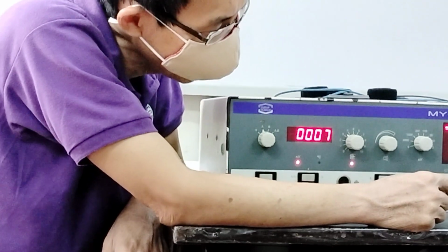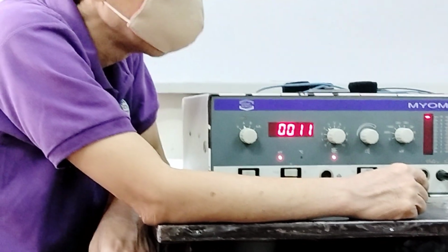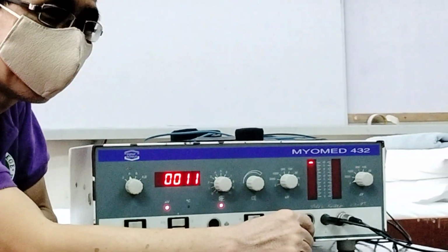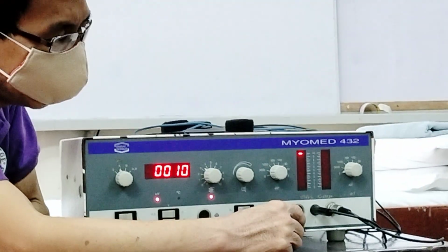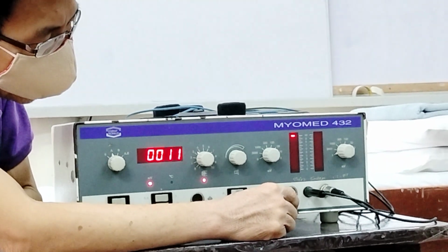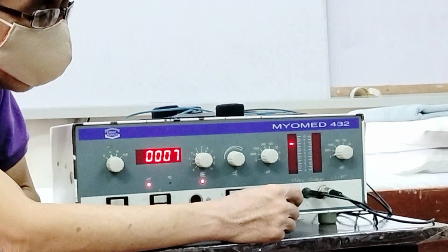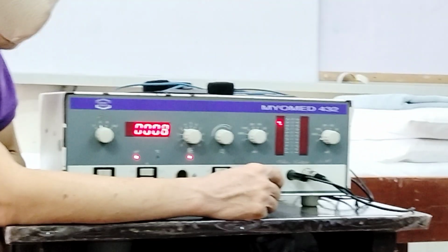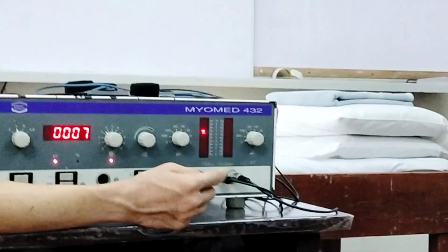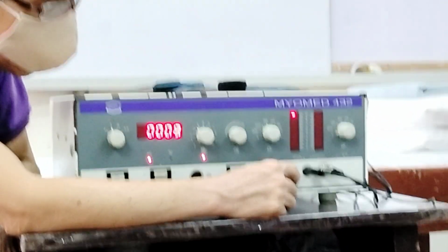So once ma-reach na niya ang 10, okay, steady siya, you can further progress. But if ever you notice that the bar is fluctuating like this one, pasabot the muscle is still not that strong, weak pa siya. So you have to still further train the patient in such a way that mas steady na ang bar. Pasabot, strong na din siya in that level.